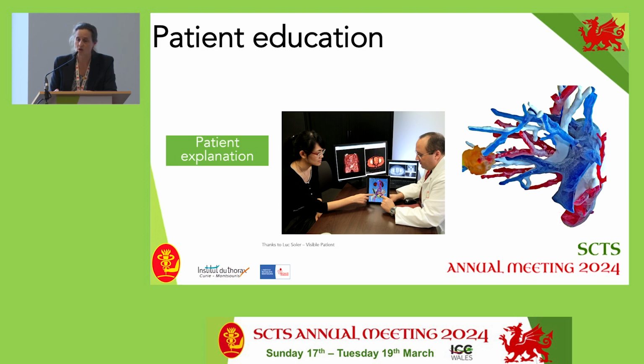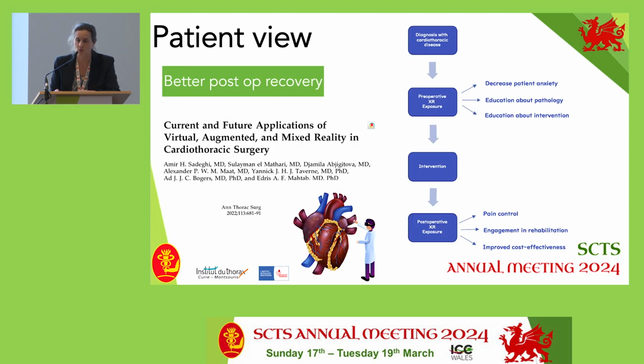And the patients love to have the printed models and to have explanation with them and say, oh, that's your tumor, see there's this vessel and I'm planning to do this segmentectomy for you. And sometimes we say, okay, we want to be sure that it's a better post-op recovery.